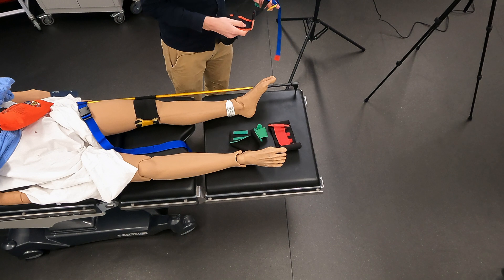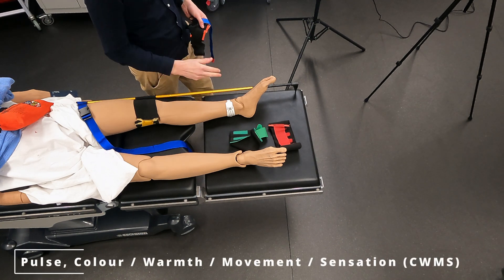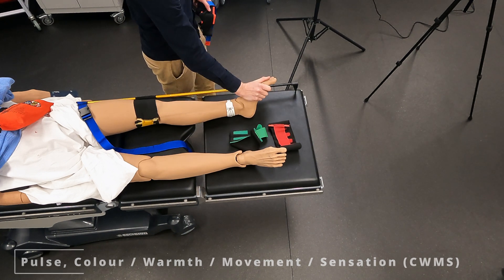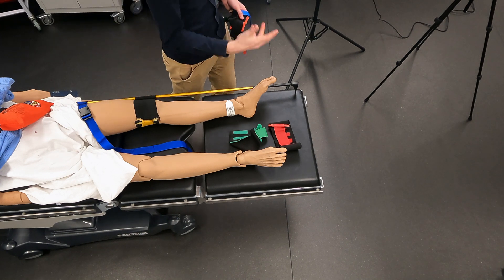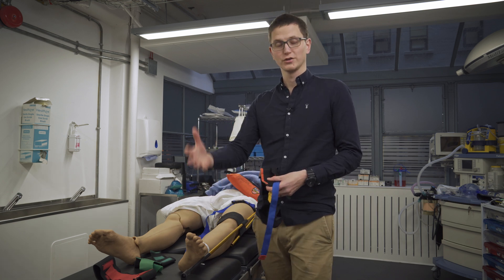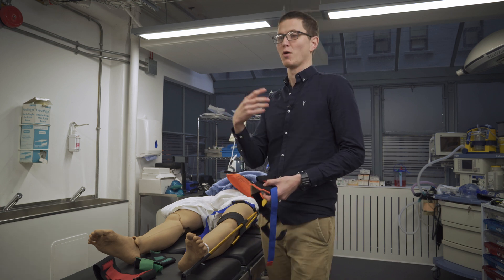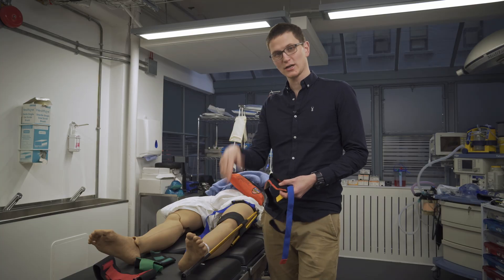Before we do this, we want to assess for pulse, warmth, motor, and sensation. Do we have a pedal pulse? Do we have motion? Do we have sensation? What is the color and temperature difference? We need to know if we have perfusion to the foot. A trick: you can put the SATS probe onto the toe you think has no blood flow. If the SATS probe picks up a pulsatile blood flow and gives a reliable SATS reading, that tells us there is actually blood flow to that foot.